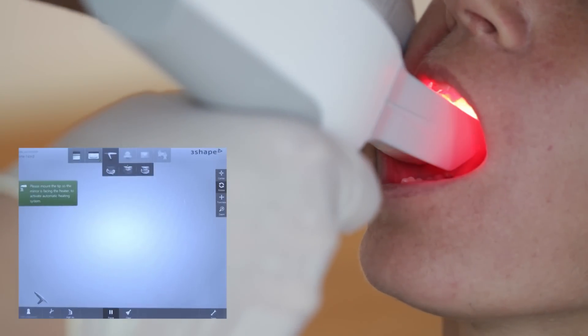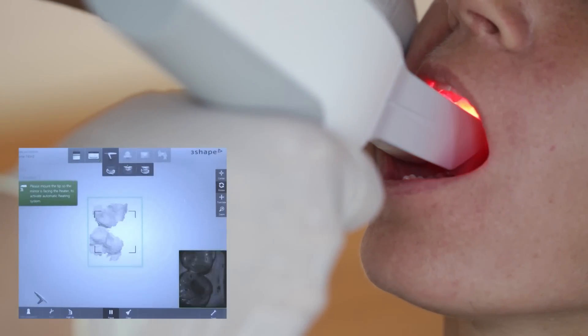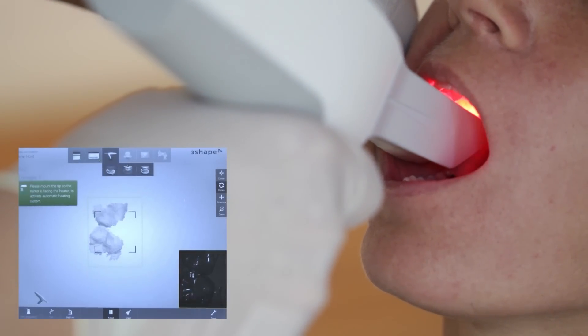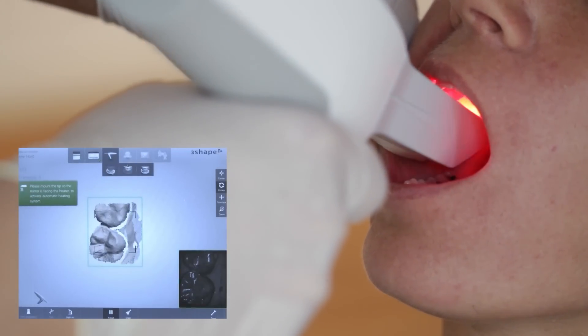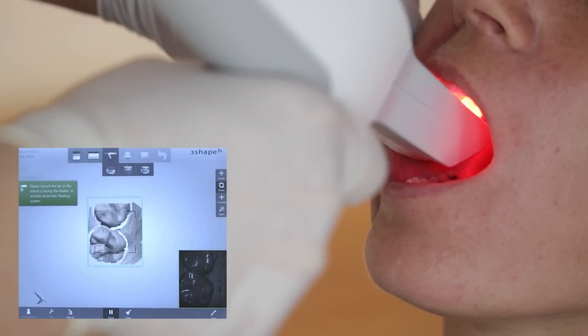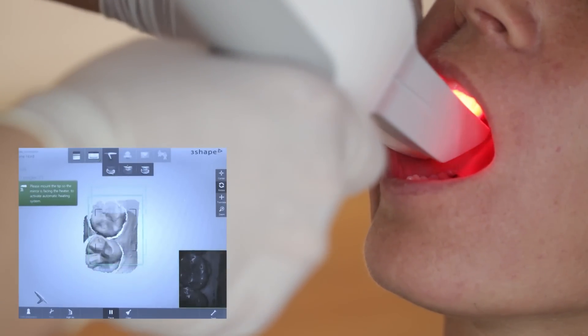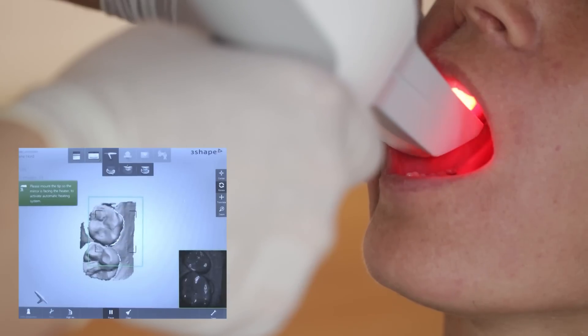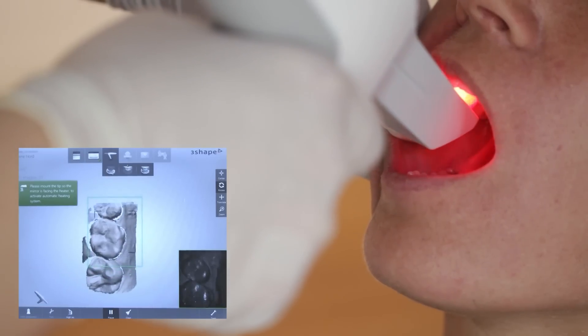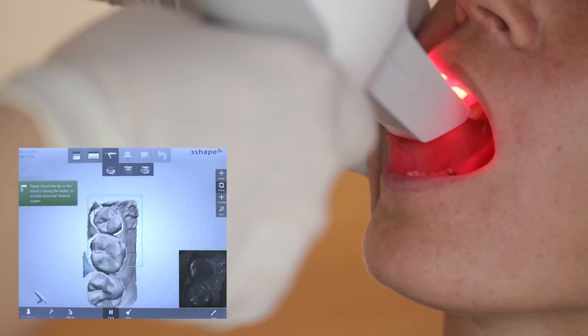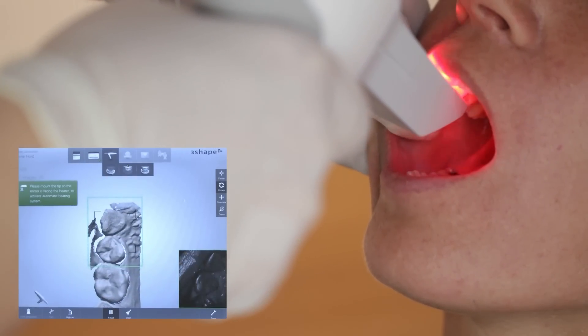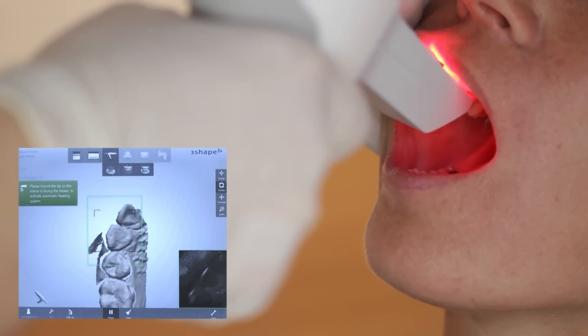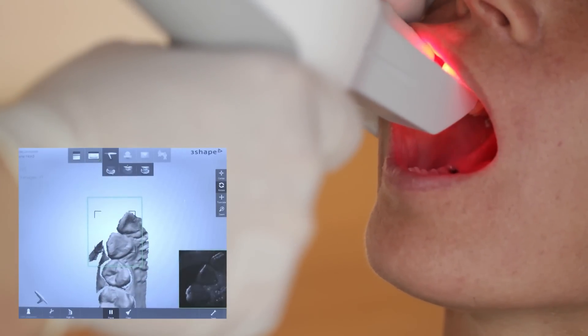It's easiest to start scanning on the occlusal part of the first molar because this area has plenty of 3D structure. After a few clicks, the starting point will be built up and you can begin your pass along the occlusion.